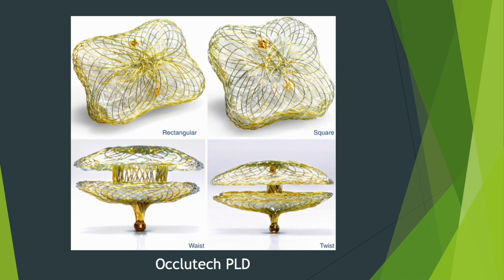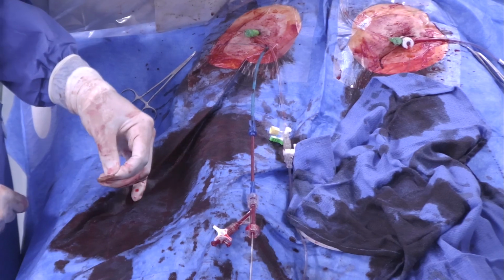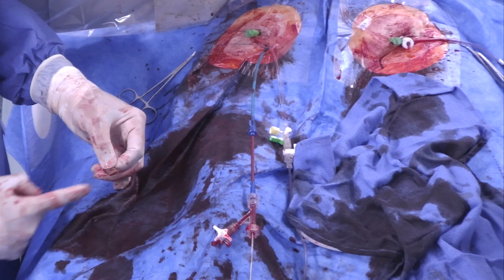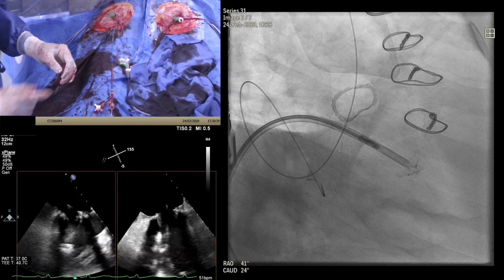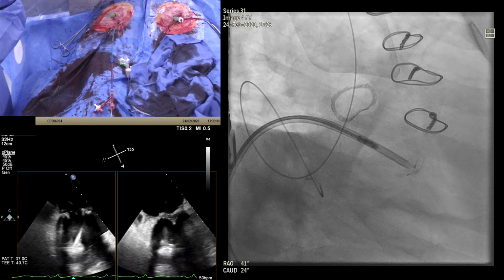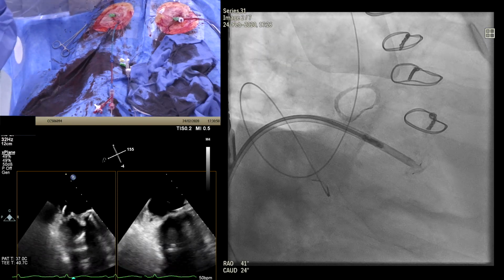So the two gold markers are on the short axis. So if I can see both gold markers apart, I must be looking down the short axis. If I can see them in a line, then I must be looking at the long axis. So given that, seeing them together, we're seeing the long axis. Seeing them apart, we're seeing the short axis. Okay, so let's see what the fluoroscopy actually shows. So play the fluoroscopy. Okay, you can see the two gold markers are separated. Okay, so we're looking down the short axis of the device.